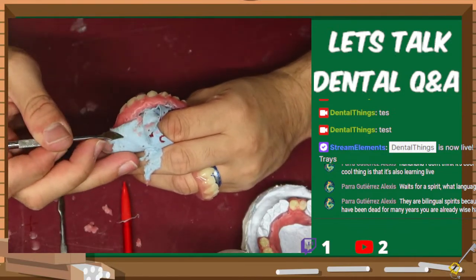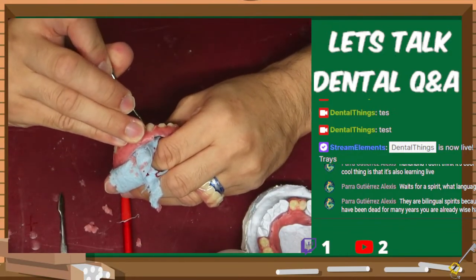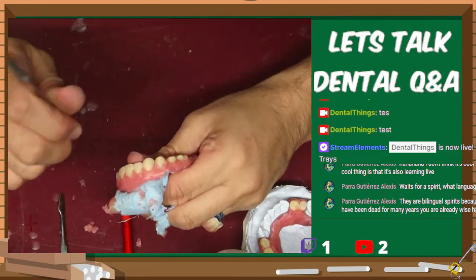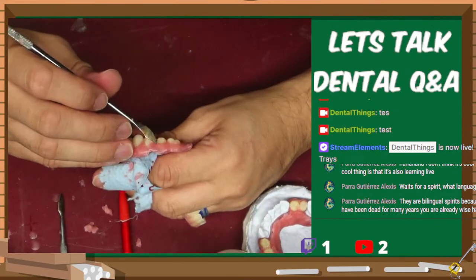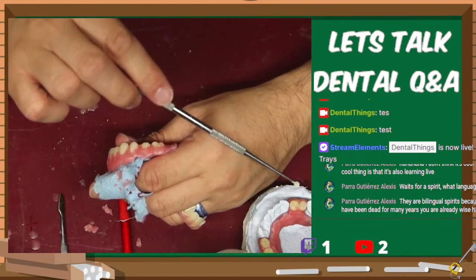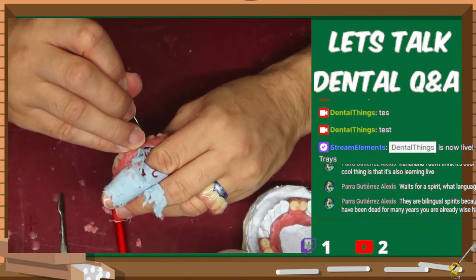Let's see how far we can go. This tooth has a little bit of rotation on it. Or not rotation, this one has a lot of lean to it. So I need to go and shift that back into place in not too long. Both of these actually have pretty good lean. I think that's probably what I have going on in this cast over here to make it match. So I'll double check that not too long.